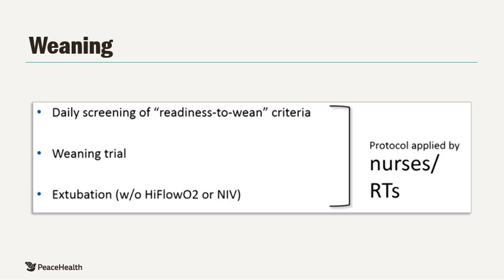We still follow our facility's protocols for assessing weaning trials and extubation options. However, with ASV, you have tools at your disposal that can offer you, as a caregiver, the objective information needed to safely execute our facility's protocols. The main tool at your disposal is the vent status screen.